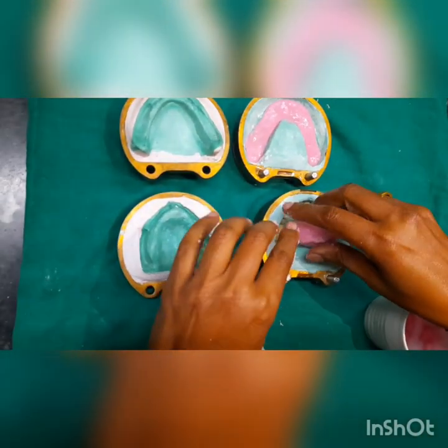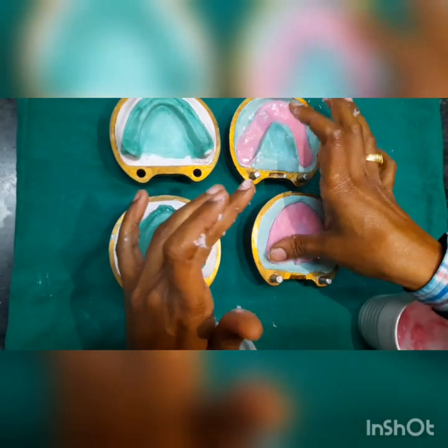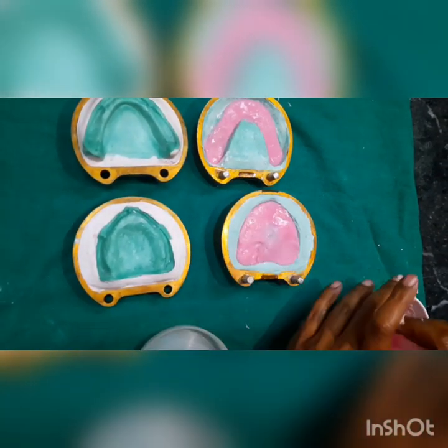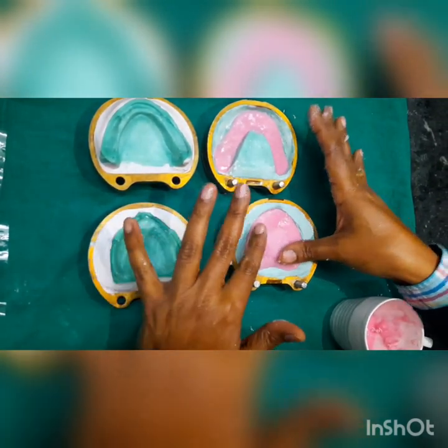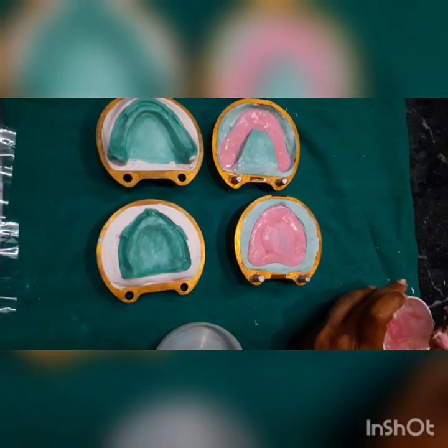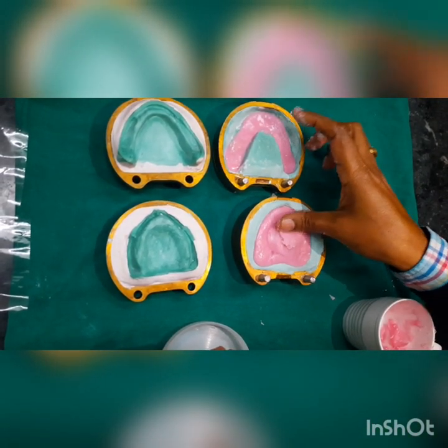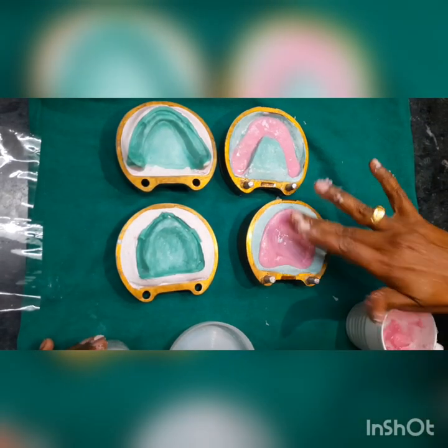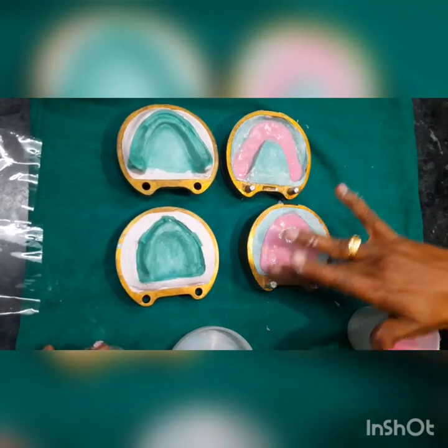For the upper mold, we form the material into a ball, apply it in the center, and press it all over. Make sure there is no area left without resin. Apply a layer and smooth out whatever you have mixed.